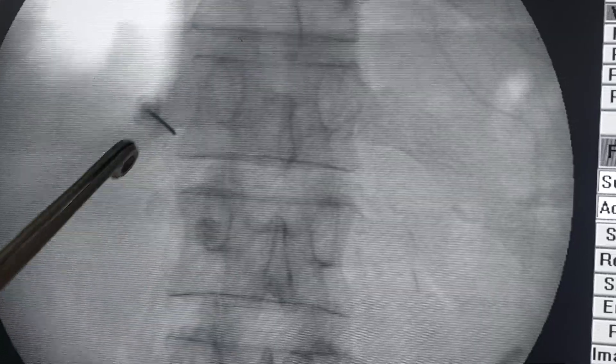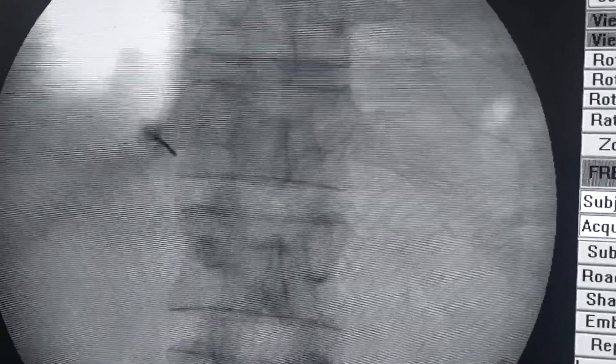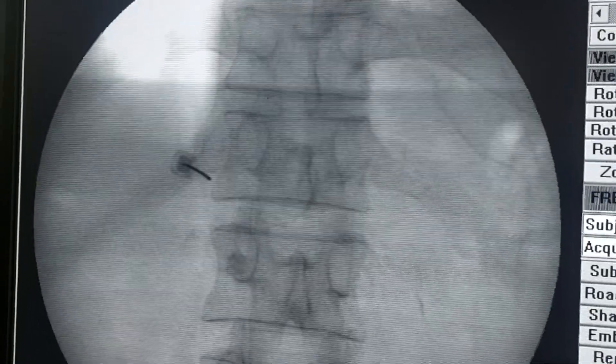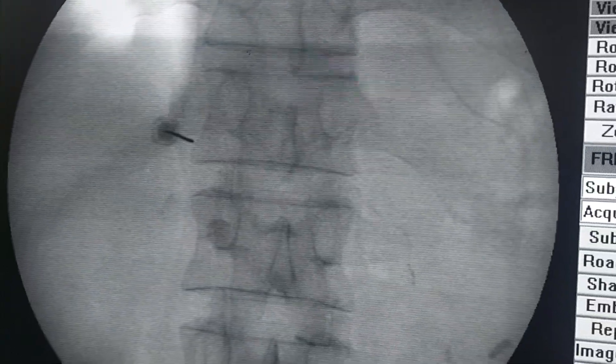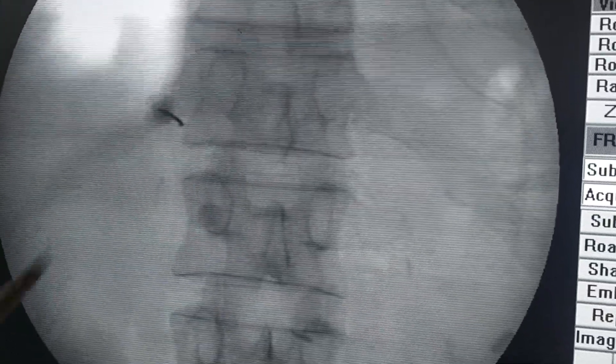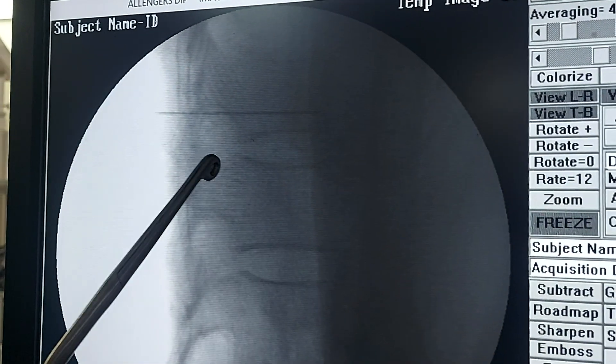You can see the needle is entering. As we advance the needle we will try to hit the bone, but in this case we didn't hit the bone and had gone in significantly. So we'll take a lateral shoot to assess needle position.